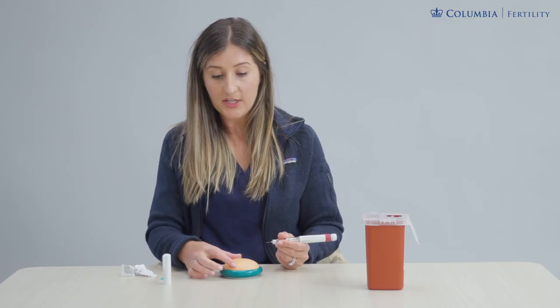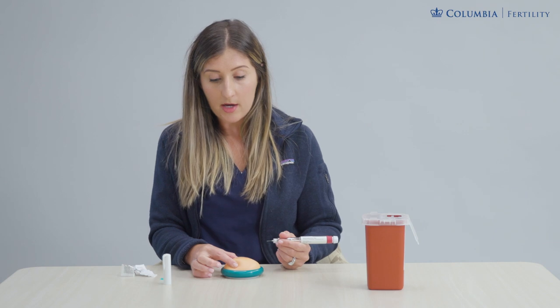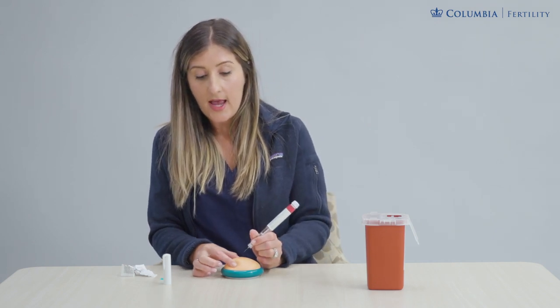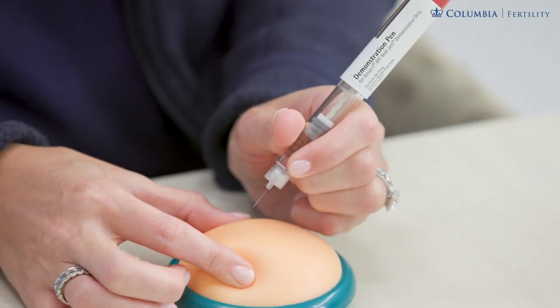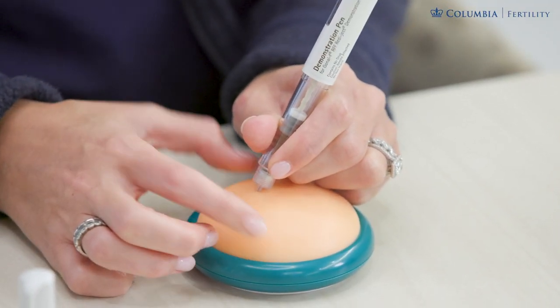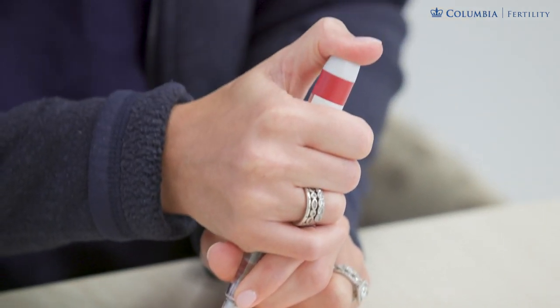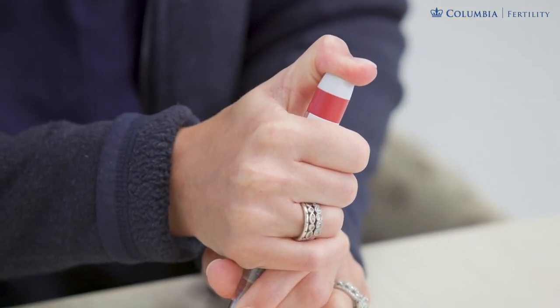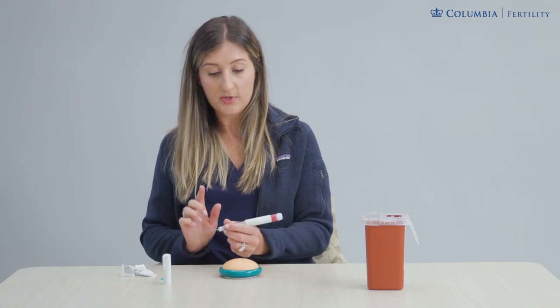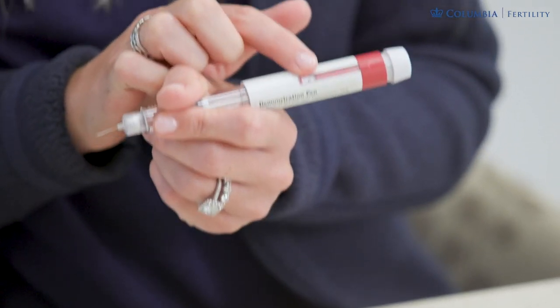Pinch that skin and go in at about a 45 to 90 degree angle — any of that is safe. Dart the needle in: one, two, three — the whole needle tip goes in. Release your pinching hand and push the plunger down all the way so it's fully depressed. When you release and take the needle out, double-check that the window on your pen has reset back to zero, which confirms that the full dose was administered when you pushed the plunger down.